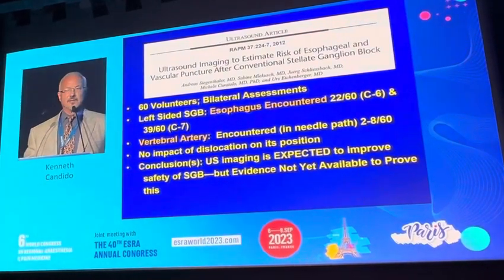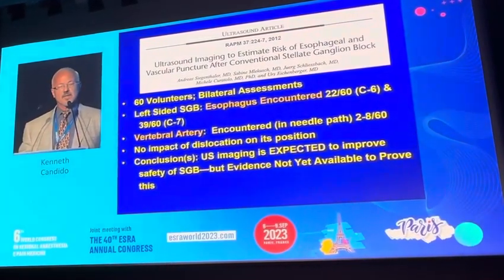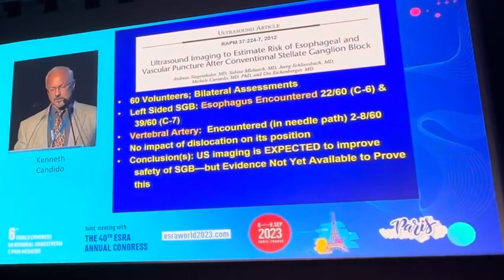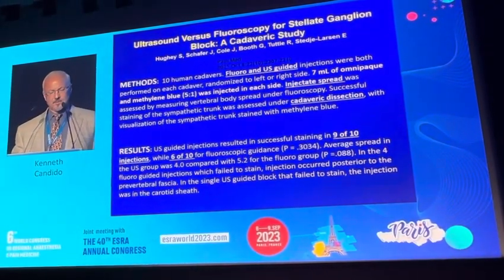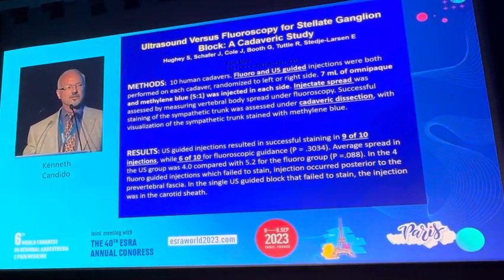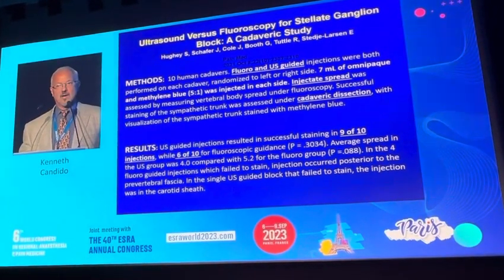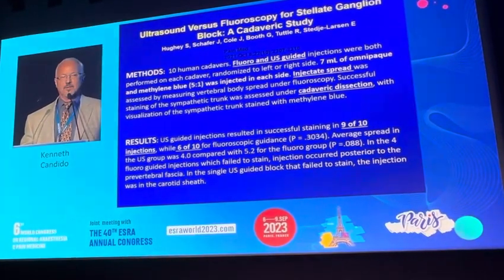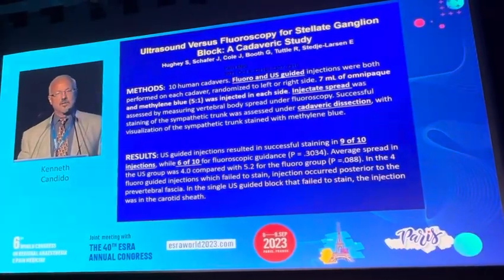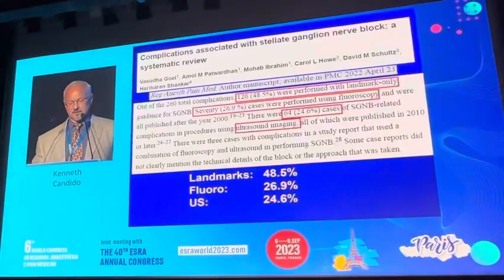Well, the studies would actually show that there is no benefit in terms of either efficacy, success, or complications. These are some of the studies which I referenced. This is a cadaver study just recently published, which showed that although ultrasound seemed to have a higher efficacy in cadavers for placing the methylene blue directly over the target, in point of fact, it was not statistically significant.